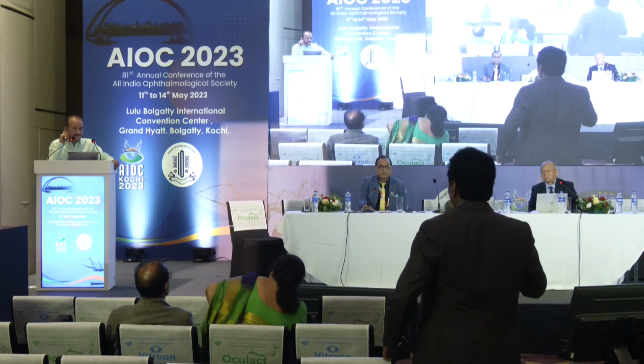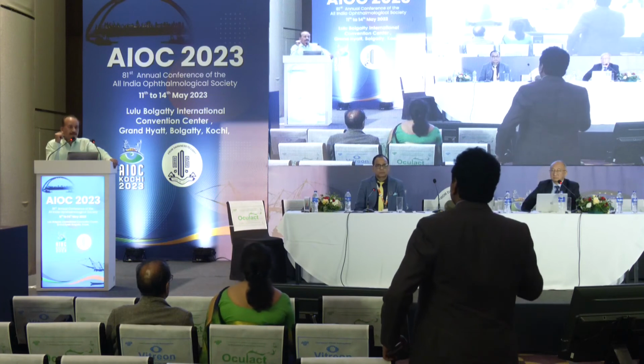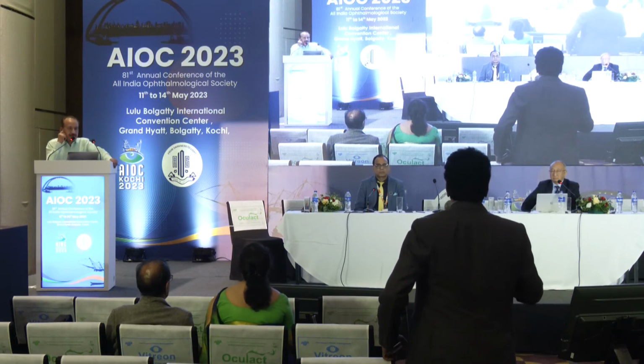Yes, we have a question. Yes, Professor. There was this post-RK patient in whom you had explanted the IOL from the bag because there was a refractive surprise probably. Why didn't you go in for a Sulcoflex or some lens like that and correct the error? Instead of taking the whole lens out and causing so much trauma, we could have just gone in for a Sulcoflex IOL or a post-pseudophakic correction complementary IOL, as they would like.